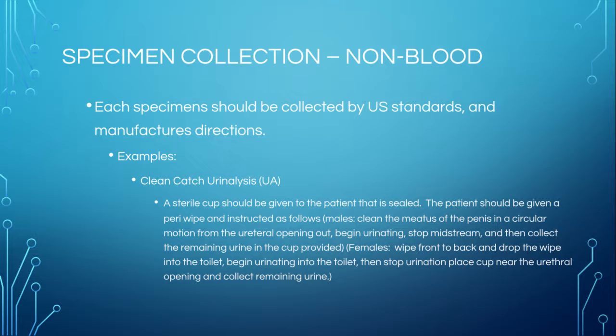If you're going to do a urine dipstick on it, and just one where you're going to read it yourself, you're going to put your gloves on. You're going to take that specimen out of the biohazard container. You're going to put the urine dipstick in, depending on which urine dipstick you're using and which manufacturer. It may be to put it in there for 30 seconds. It may be a minute. It may be 2 minutes. Then you're going to set it out on a paper towel for X amount of time, whatever the manufacturer recommendation is.